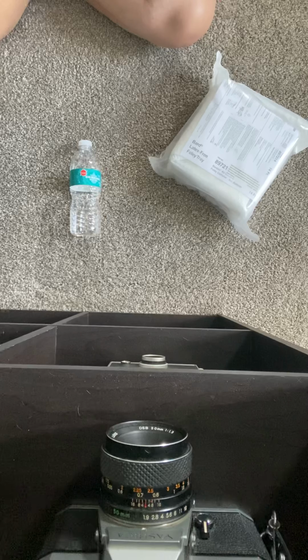So if they were retaining urine, or multiple straight caths have occurred and the Foley needs to go back in. And then I'm gonna let them know that I'm gonna clean really well before I insert it. I want to get their consent for that. Just ask them, hey, is it okay? I think this is important, you need this. I need your yes or no for this. And then if they have any questions, give them a chance to ask any questions too.